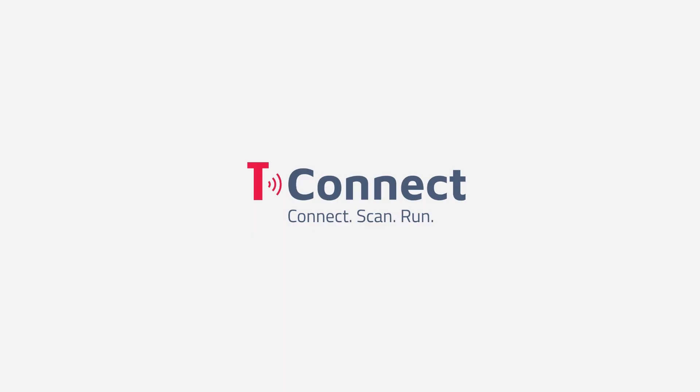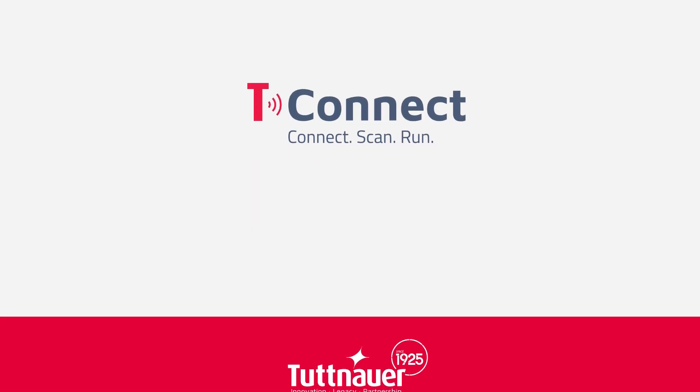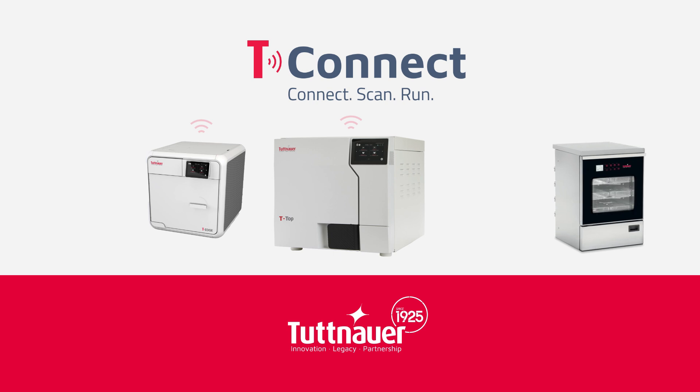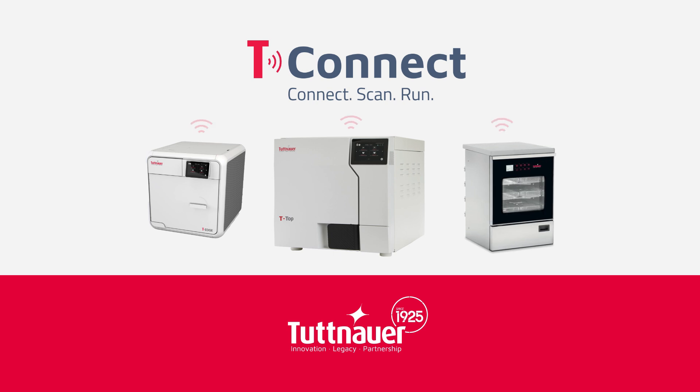Welcome to T-Connect, the game-changing software developed by Tuttnauer that redefines healthcare and laboratory sterilization centers.